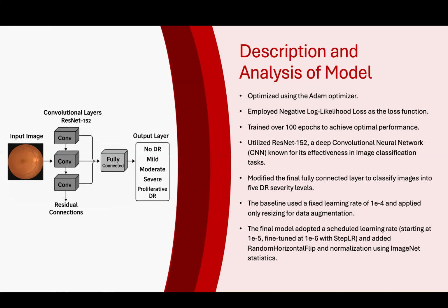We started with a simpler baseline using a fixed learning rate and minimal augmentation and gradually built toward this more robust final model. The baseline model had an accuracy of 91%, whereas we are getting an accuracy of 96% now.